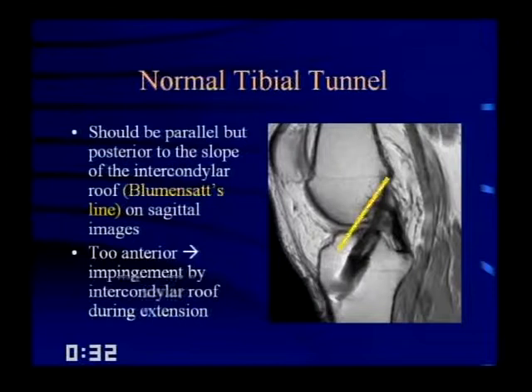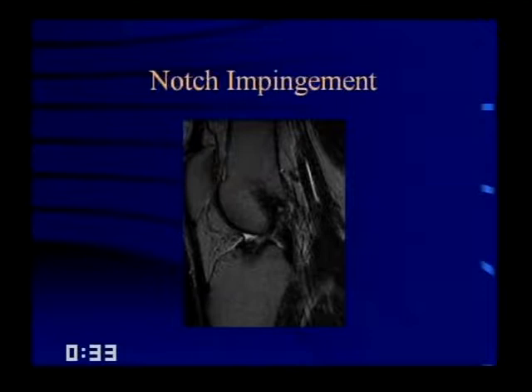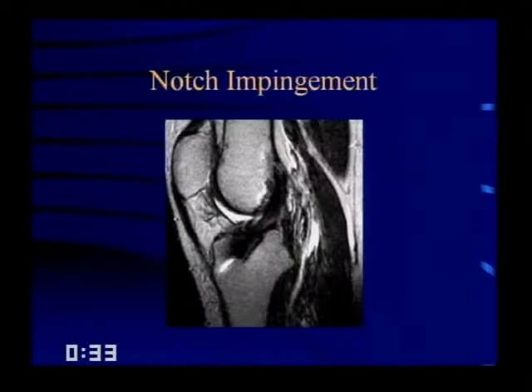The normal tibial tunnel should be parallel but posterior to the slope of the intercondylar roof — the Blumensaat line. If the tunnel is too anterior and crosses the Blumensaat line or its extension, you might get roof impingement or notch impingement. Here are two examples showing increased signal within the ACL graft where the graft slope crosses the Blumensaat line — both patients are prone to notch impingement.